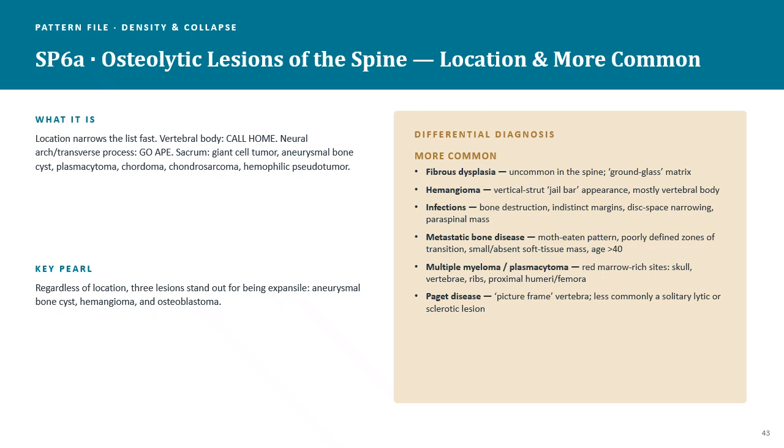All right. Now, multiple myeloma, we talked about that earlier. Multiple myeloma can affect the vertebrae, the legs, the arms, the pelvis, and also the skull and ribs. When we're seeing that condition, it produces what we call lytic lesions or punched out areas, a lot of them.